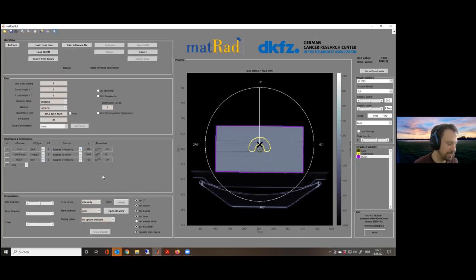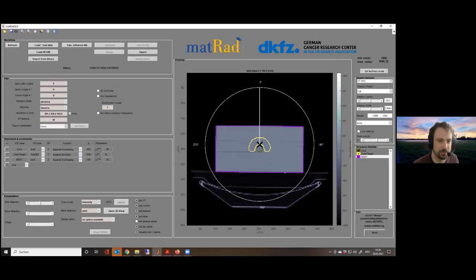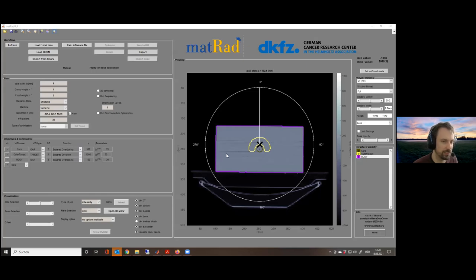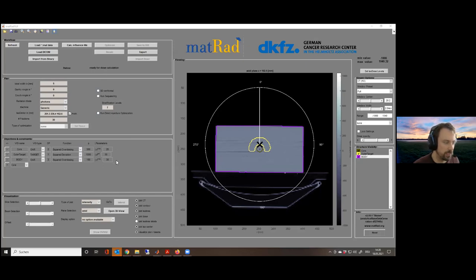We start with simple functions computing squared deviations, only positive squared deviations, or only negative squared deviations — a least squares problem. If the parameter subsection doesn't show up under objectives after loading mat data, the only reason I can think of is that your MATLAB version is too old — version 2014, 2013, or earlier might have trouble.